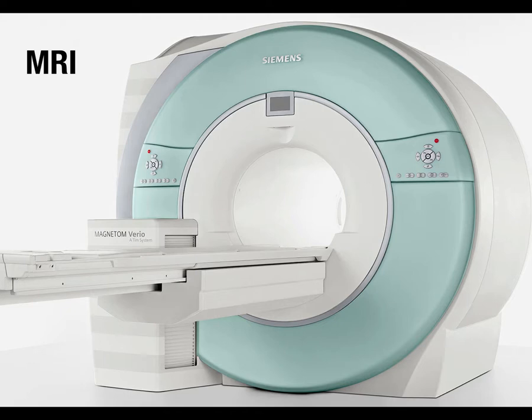So the main part is that magnetic field, and that magnetic field is always on. Then on top of that, there are radio frequency coils in there that send radio frequency energy. We'll talk about that later. There are also gradient coils that are able to adjust the strength of the magnetic field in different dimensions. So there's one magnetic field that's always on, whatever the sticker field strength of the magnet is. But then there are these other radio waves and gradient fields, and all of that hardware is encased inside that donut.